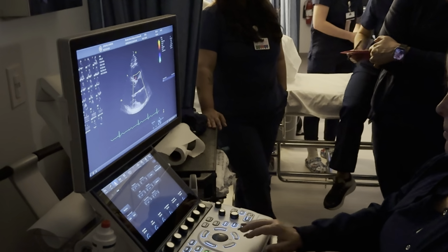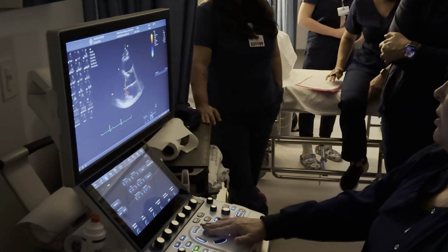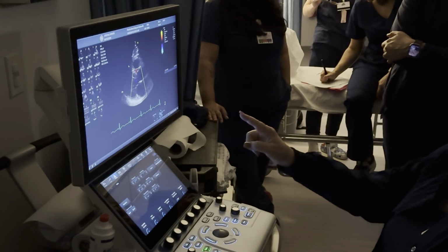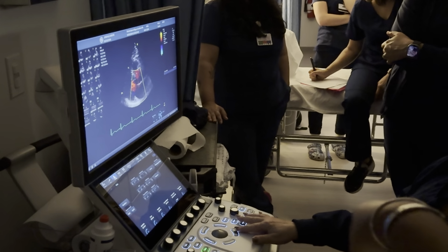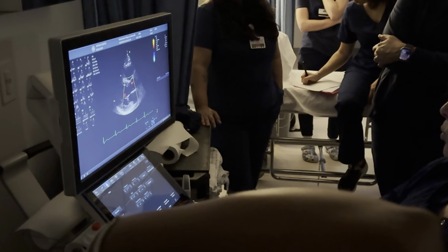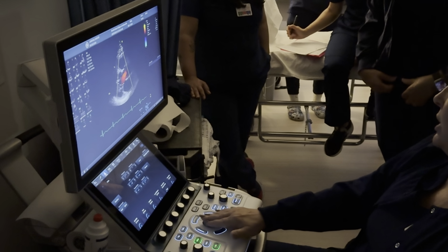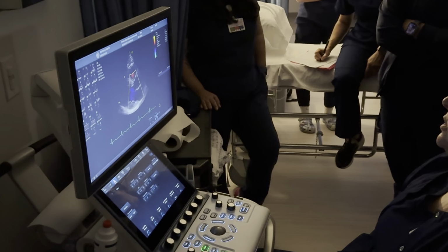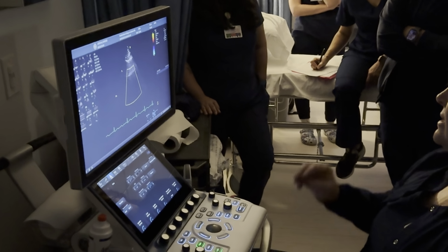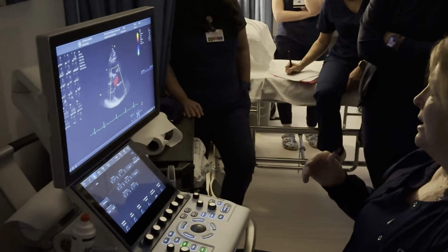And so, again, you just hit the word color. With your trackball is how you move it. And if you want to change the size of the region of interest, it's called ROI, then we just hit one of these enter buttons and move with our trackball to change the size, okay? Once I get a size, I really don't change it much, okay? Because if I change it every single time, then it's going to take me a long time.